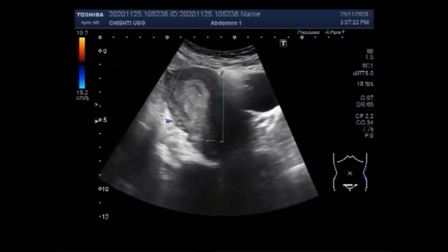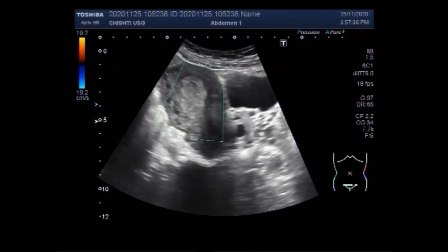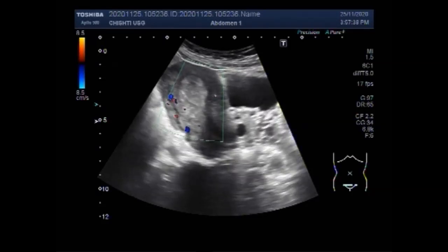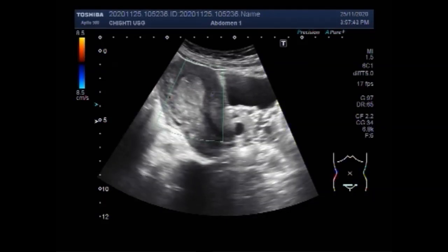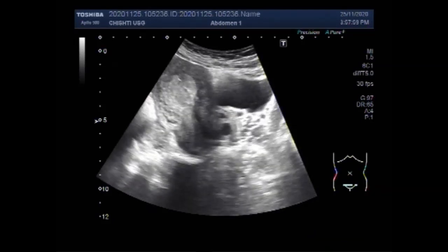Now you can see the uterine polyp. Overgrowth of cells in lining of the uterus, that is endometrium, leads to the formation of uterine polyps, also known as endometrial polyps. Endometrial polyps are benign nodular protrusions of the endometrial surface, and one of the entities included in differential of endometrial polyp is endometrial thickening.